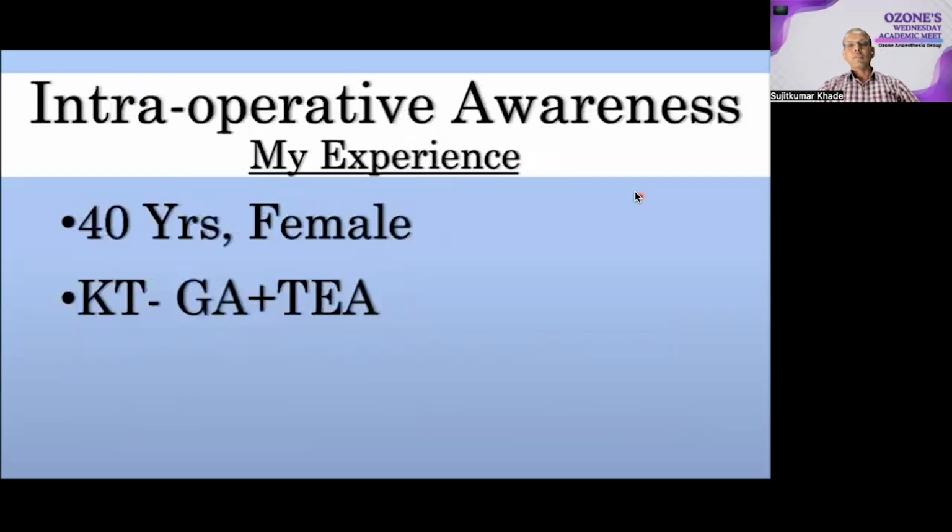In my practice of the last 20 years, this is the case who recalled everything that happened after I gave her general anesthesia. She was a 40-year-old young lady and was posted for kidney transplant. I gave her a thoracic epidural and she was induced with routine drugs like fentanyl, propofol, and intubated under atracurium. After induction, a full dose of epidural was given for analgesia. Because of CKD, her pressure was already high and she was also having tachycardia. Then once surgery started, her tachycardia and blood pressure didn't settle. Her muscle relaxant requirement was very high and she required a top-up every 15 minutes.